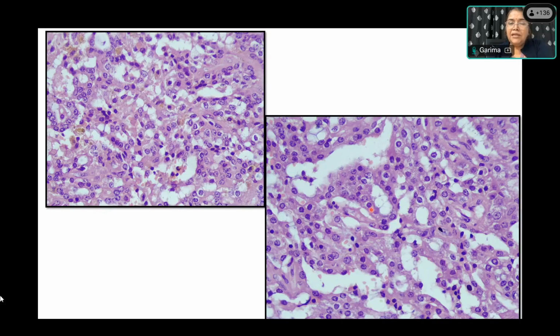You can see the acinic cell per se. Any other cell which you can see? These are mitotic, I think, somewhere; occasional mitosis was there in this. But what I'm trying to tell you is that looking at the cytoplasm, the usual, normal acinic cell looks quite blue. Here the cytoplasm is a bit eosinophilic.